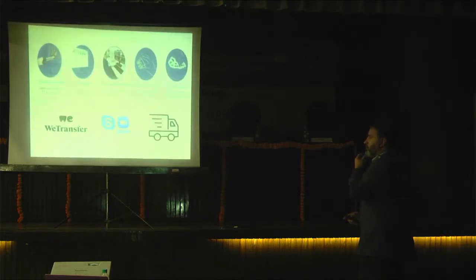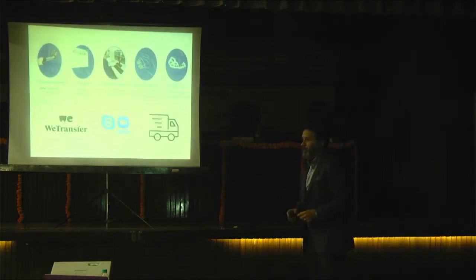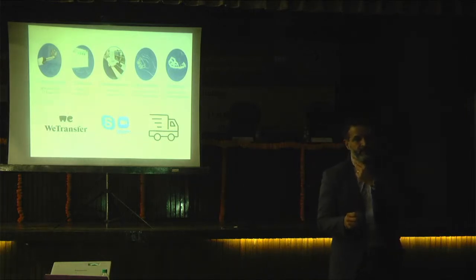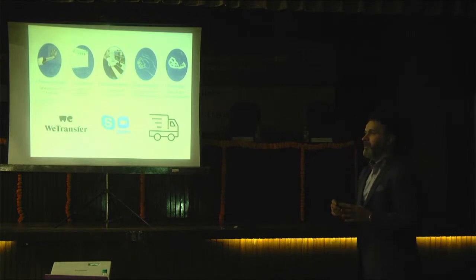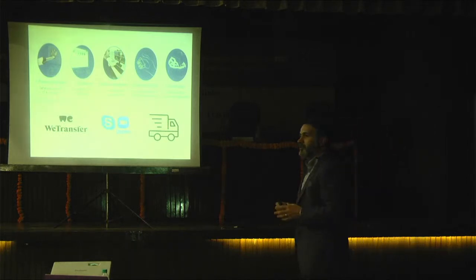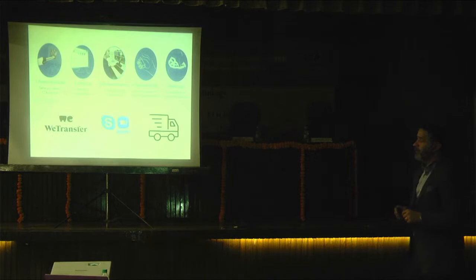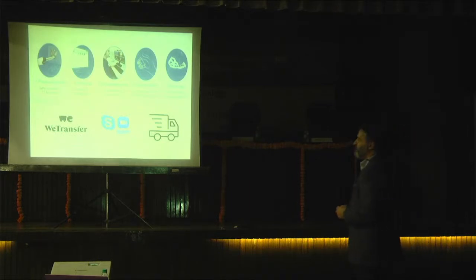First of all, we prepare a patient and get our patient's CT files, as you have the machine in your college. But there are some rules when taking the CBCT, and after it, you must contact us, contact my friend Pratik. I don't know if there is an M center here in India.